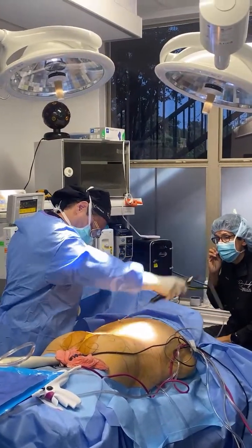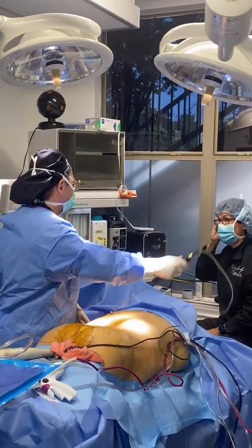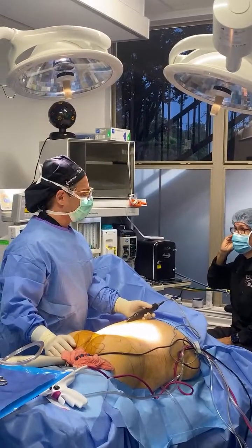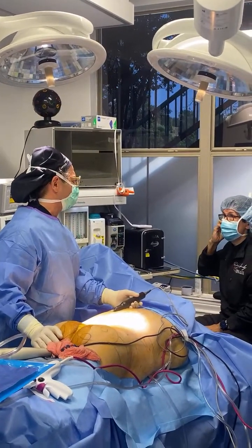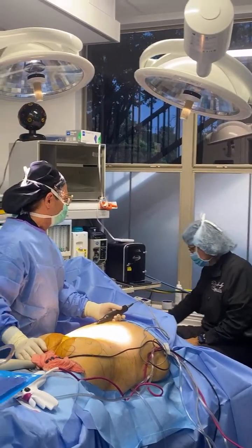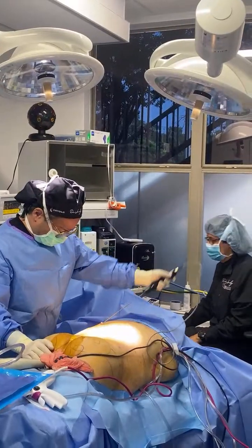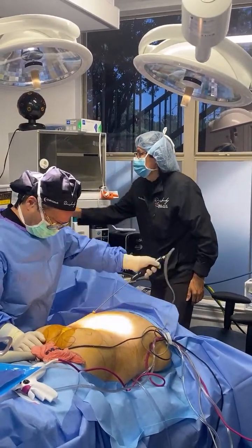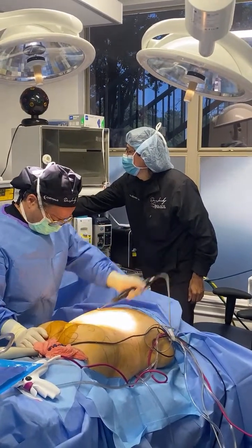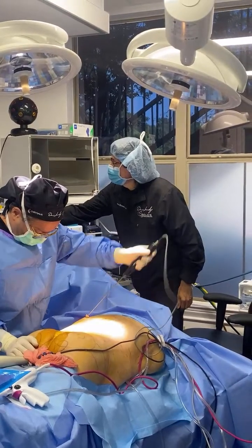For those who are just hopping on, we are on our second part of today's surgery, our first surgery. Earlier, we had our patient lying on their back, and we were doing lipo 360 around her abdomen. And we paused and flipped her onto her stomach now. And we're finishing up that lipo 360. And then later, we're going to go into our butt lift. And our patient is also getting Renuvion done today.